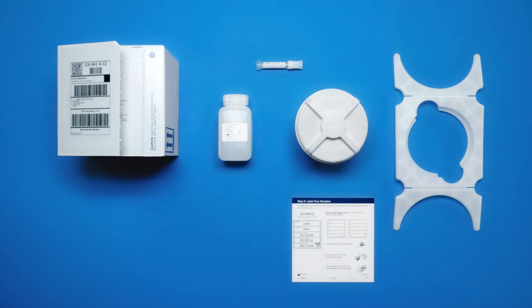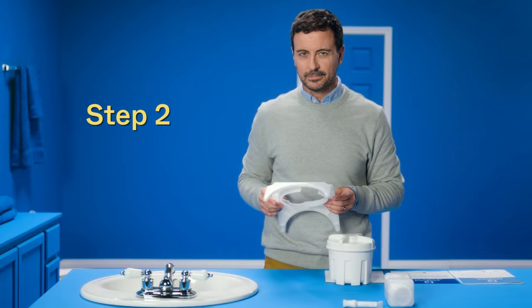As you unpack the box, take your time to check that you have your sample container, bottle of preservative liquid, bracket, and sample labels. Have everything laid out? On to Step 2.